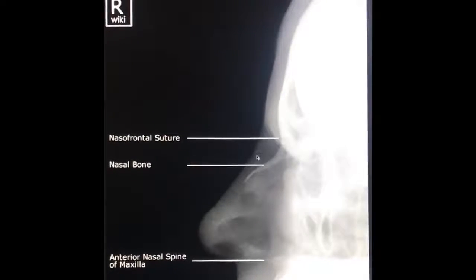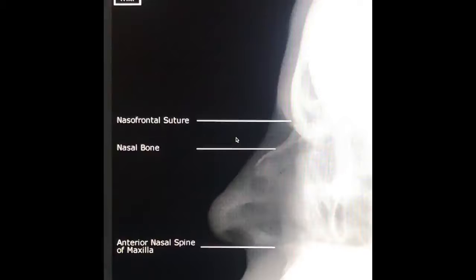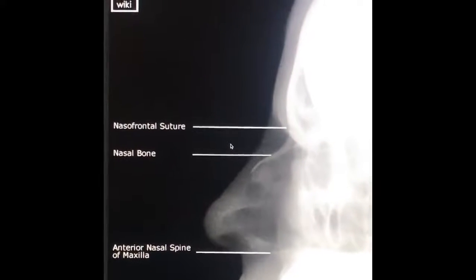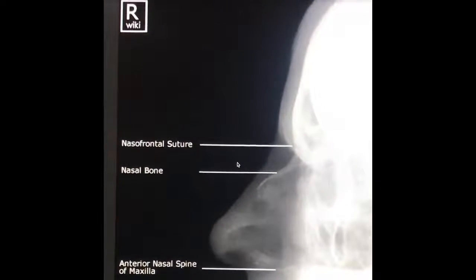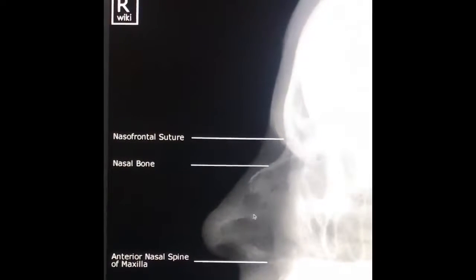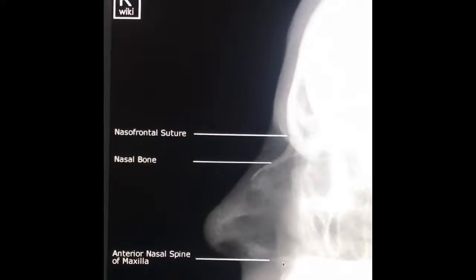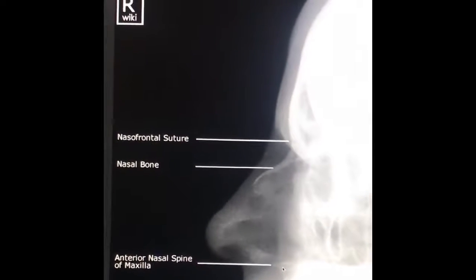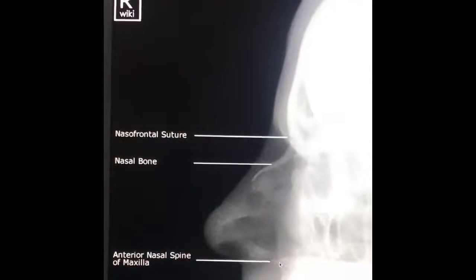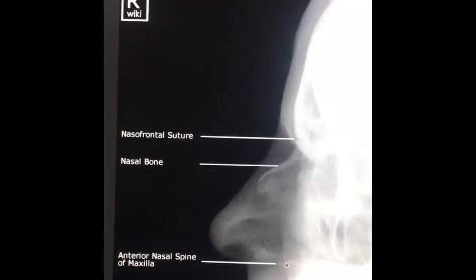But there shouldn't be any motion, and that's evident when you have sharp bony outlines or margins. Your area of interest that needs to be included is your nasal bone with the surrounding soft tissue structures as well as your anterior nasal spine. You must be able to collimate to include the nasal bone. When you center, you should center the image at the level just below the nasion.